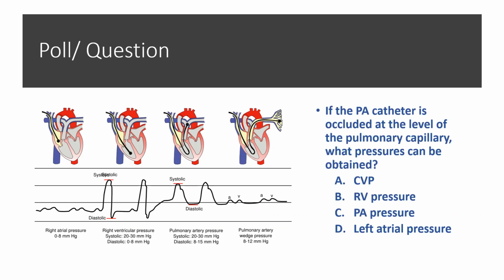An artery. Very good. So we do not want to have a long-term catheter that's inserted into the artery all the way into the heart. This would be very, very dangerous. And that is the reason why it is much more favorable to have a catheter that enters through a vein rather than an artery. Okay.